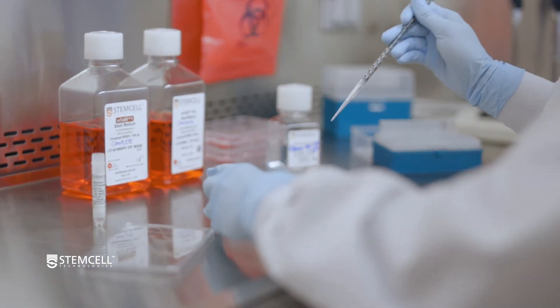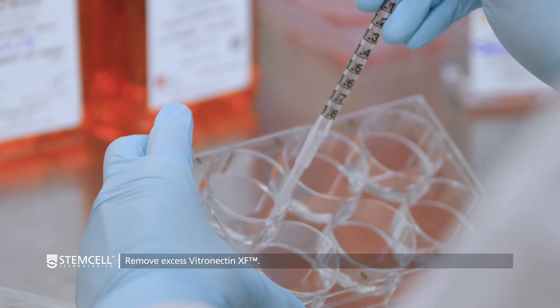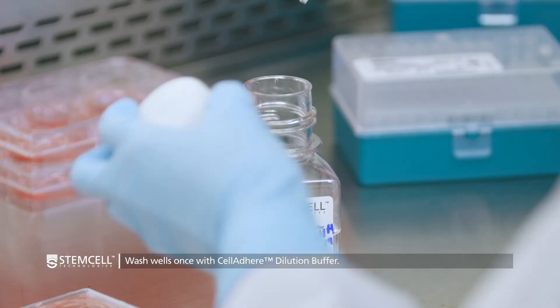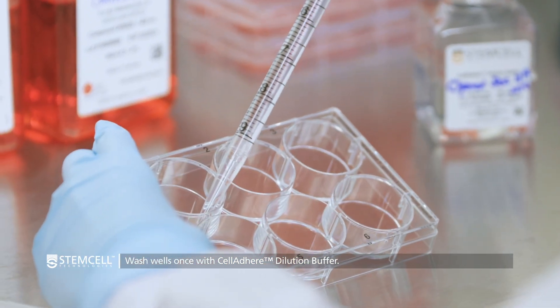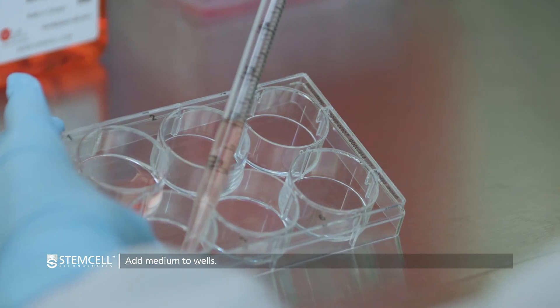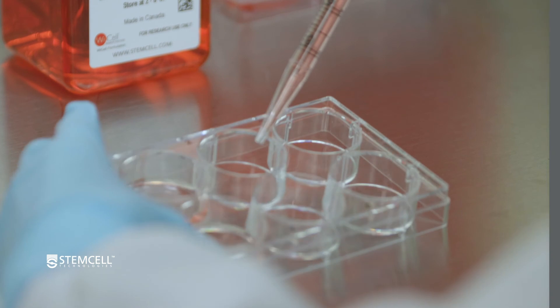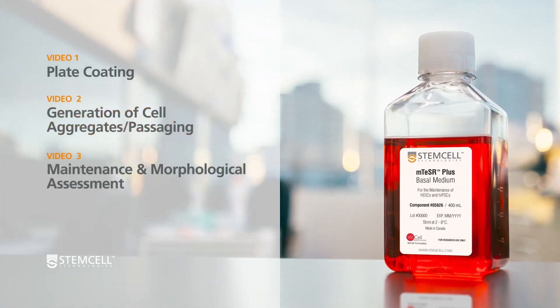Now tilt the plate to the side and aspirate the excess Vitronectin XF solution carefully, ensuring that the coated surface is not scratched with the pipette or tip. Wash the coated wells once with 2 milliliters of cell adhere dilution buffer per each well of a coated 6-well plate. Aspirate the wash solution and add 2 milliliters of appropriate medium to each well. If you are using other sized cultureware, volumes will have to be adjusted. For the next step in the process, proceed to Video 2, Generation of Cell Aggregates and Passaging.